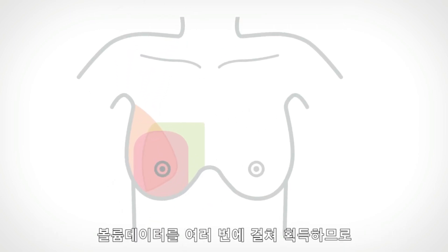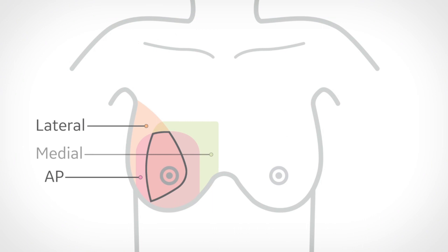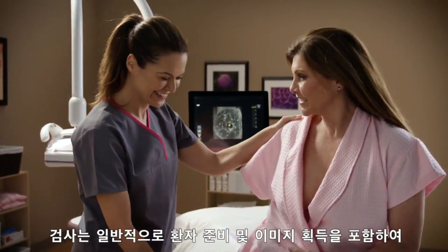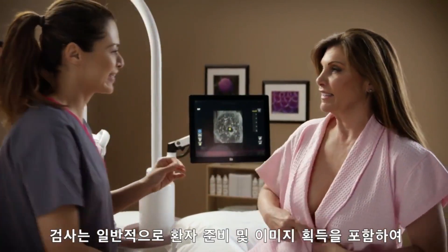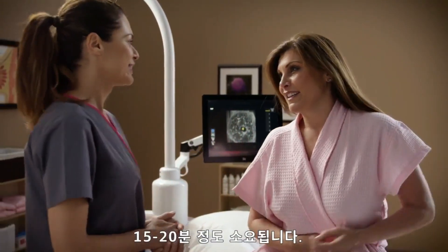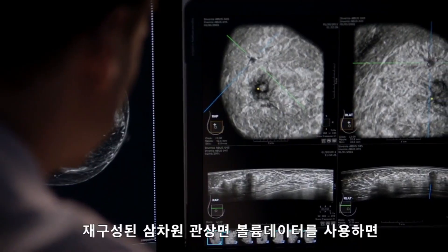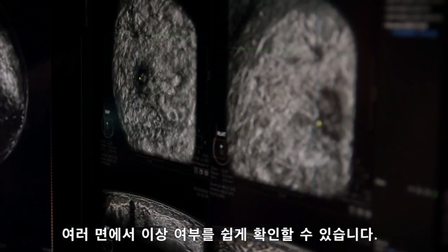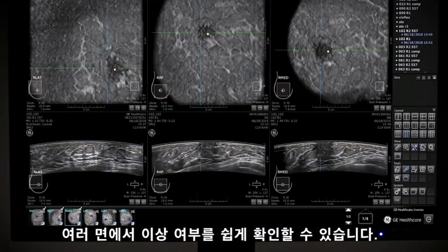These volumes overlap, allowing for additional coverage of the central aspect of the breast where typically the denser cone of breast tissue exists. The full exam is typically 15 to 20 minutes, which includes patient preparation and image acquisition. The reconstructed 3D coronal slices allow for easy visualization of abnormalities on multiple views.